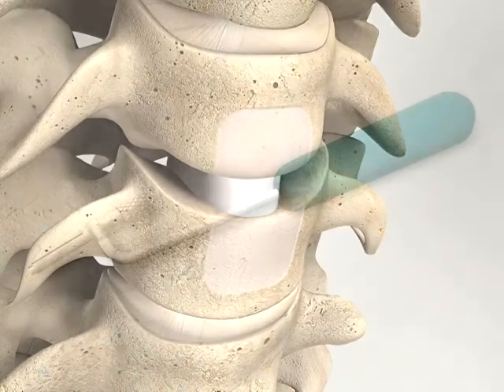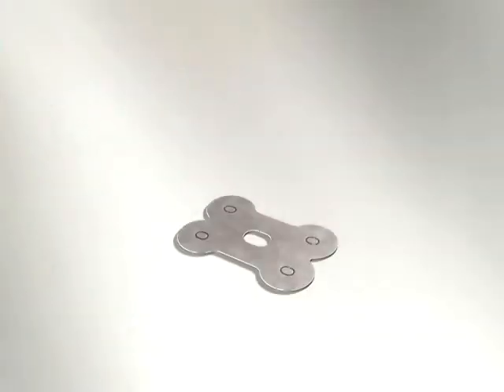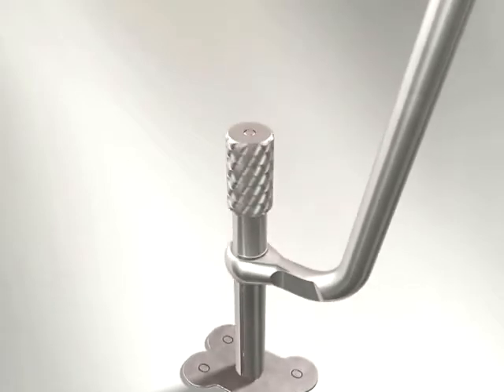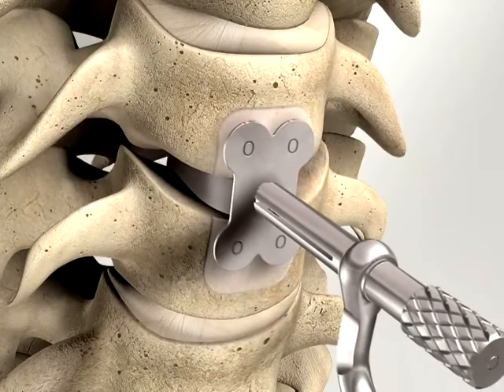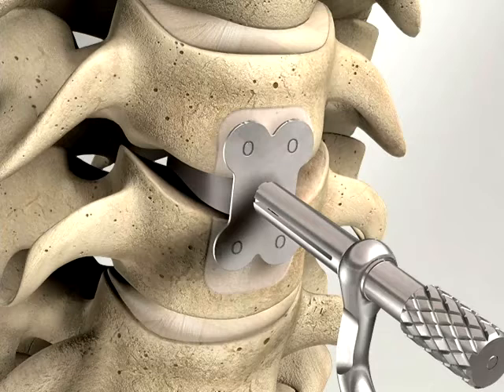Implantation: Use the plate templates mounted on the plate holder to determine the appropriate plate size. Place the suitable size template against the bone at the intended location of the plate to confirm correct plate length and screw hole position relative to the end plates. The templates can be bent with the plate bending pliers to adapt them to the anterior bone surface.